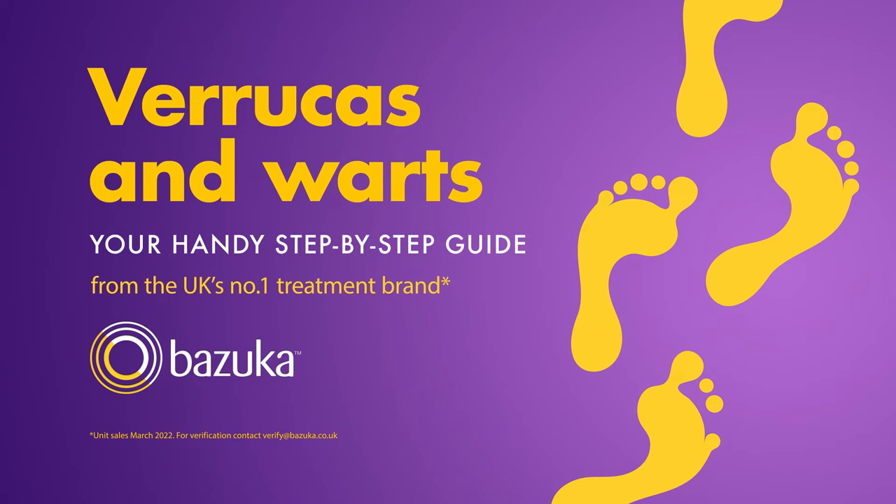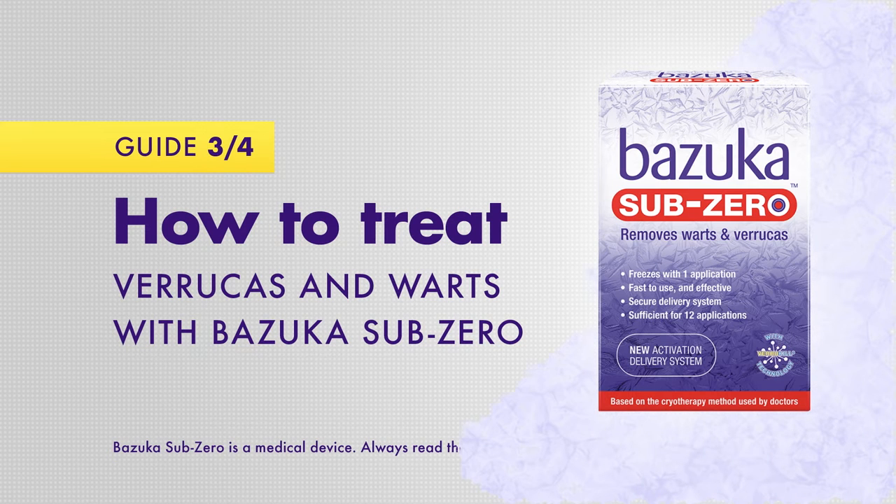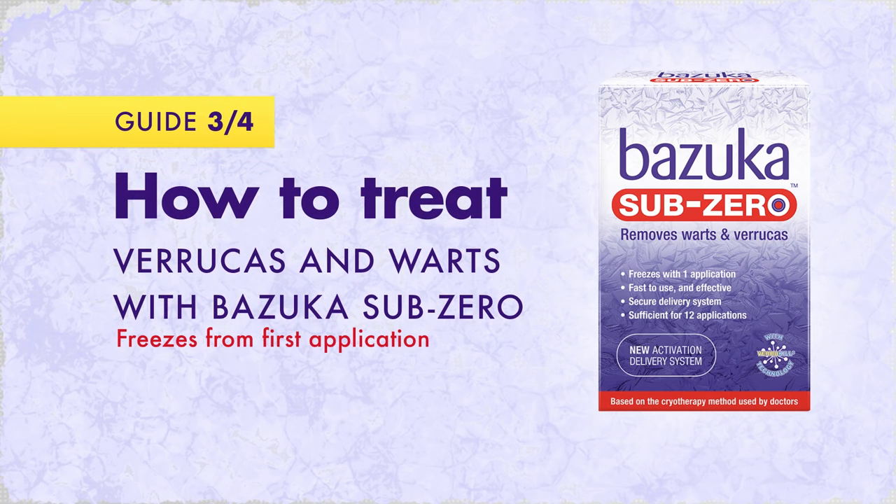Verrucas and warts: your handy step-by-step guide. Here's how you can treat verrucas and warts with Bazuka Sub-Zero. Based on the cryotherapy freezing technique used by doctors, Bazuka Sub-Zero freezes the verruca or wart from first application. It's fast to use and effective.